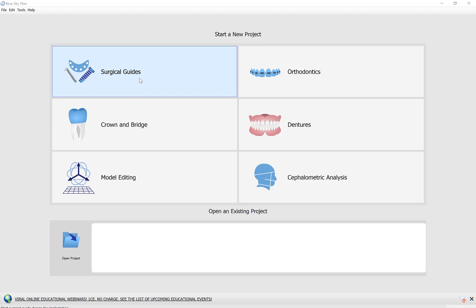Some companies give us all the relevant information together with the surgical guide data, which is great. Sometimes a company chooses to integrate their implant system but doesn't give us the guided surgical kit information. In such a situation, we offer the Blue Sky Bio kits as a universal guided surgical kit option, and then after creating an osteotomy, the user could remove the surgical guide and use the manufacturer's appropriate drill to finalize the shape and size of the osteotomy.